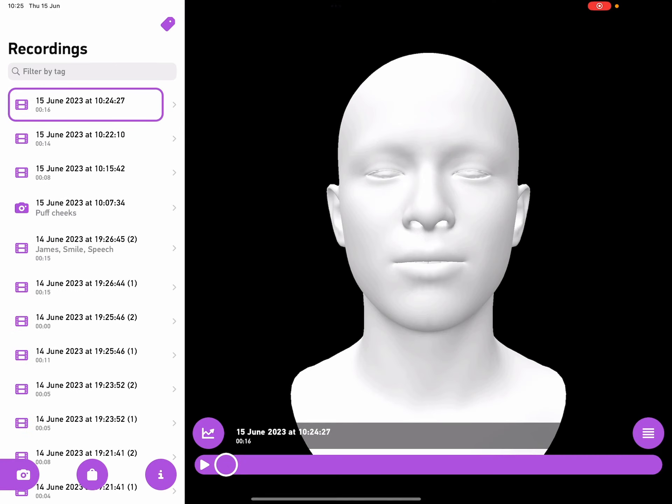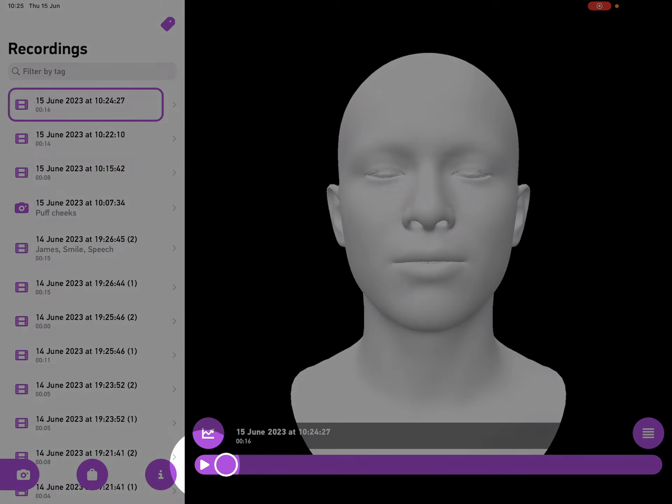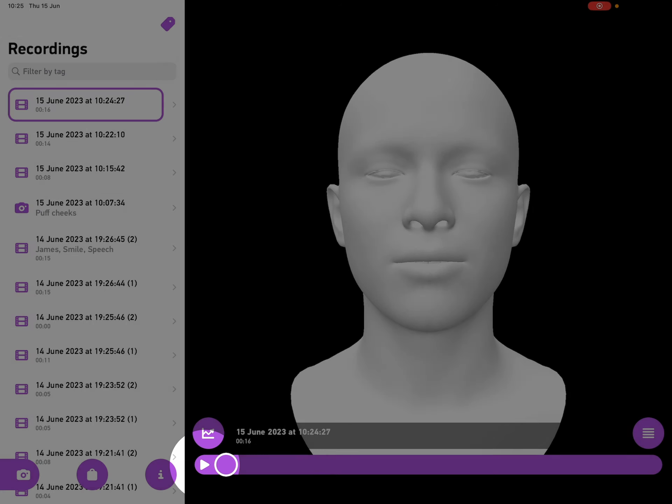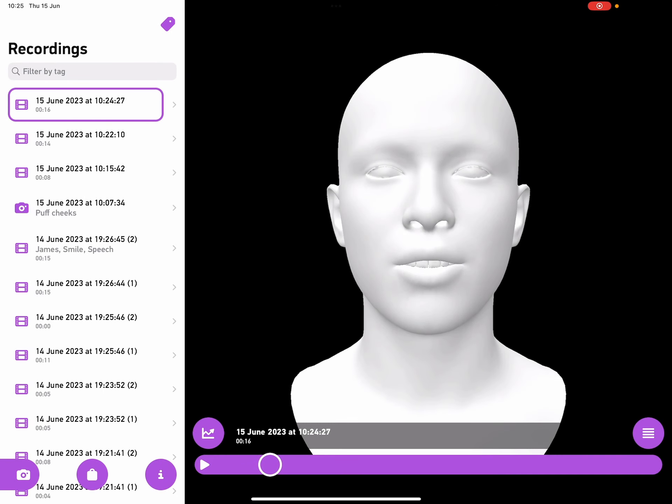And here what you can see is a 3D visualization of the movements that I was making when I was speaking. And along the bottom we've got a progress bar, and I can tap on the play button on that progress bar and we can see a replay of me speaking to you.